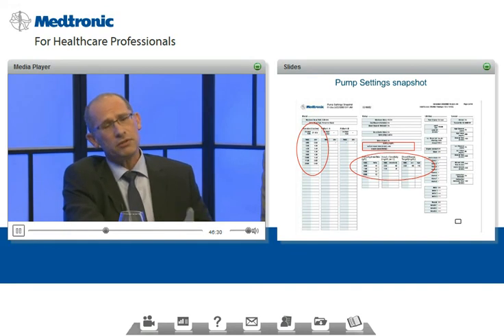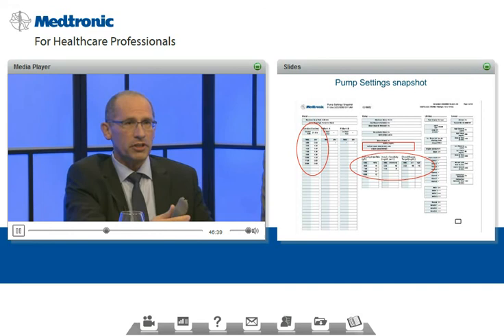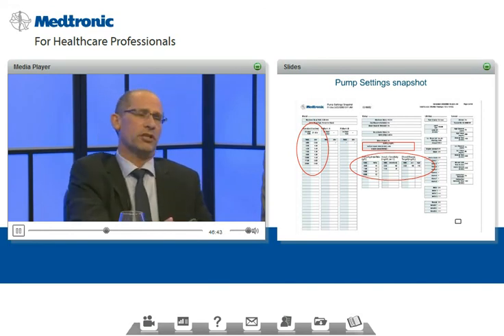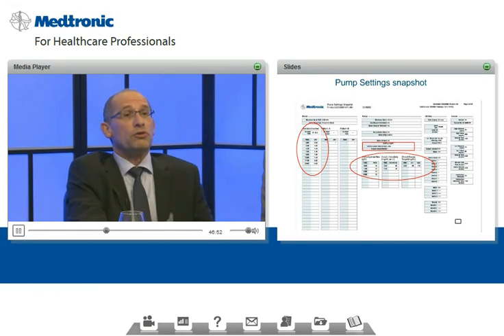but this is a very important part of treating our patients. Because, as we talked before, we want our patients to stay using CGM as long as they can, more than 70%, more than 80%. And one of the main reasons for patients to leave the CGM is what we call alarm fatigue, turning on all the alarms: the high alarms, the trend alarms, the low alarms, and the low glucose suspension alarms.